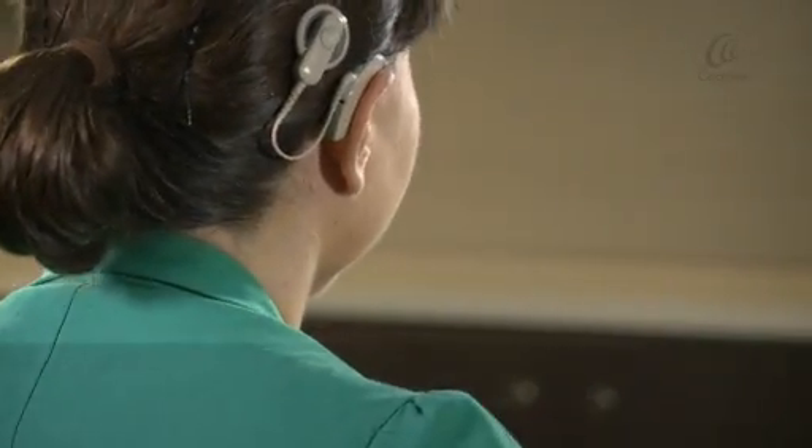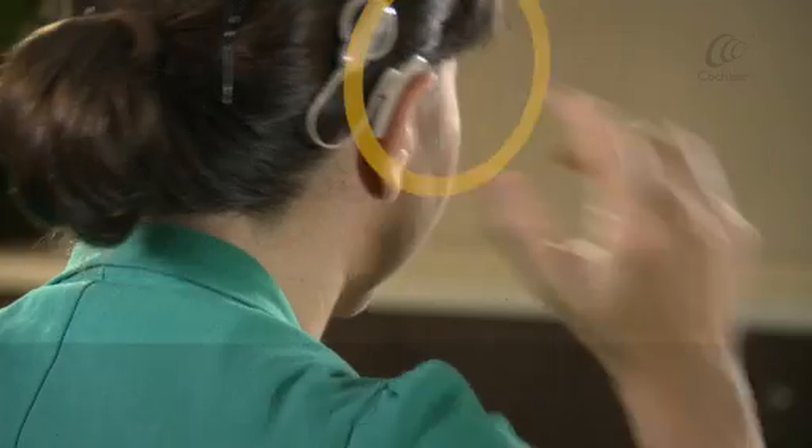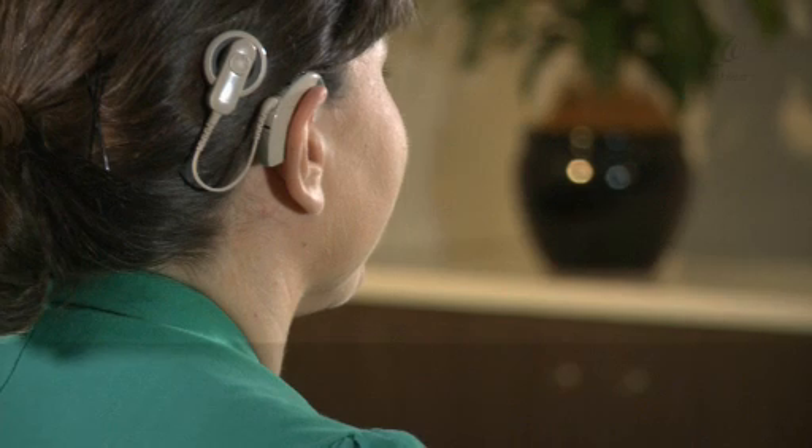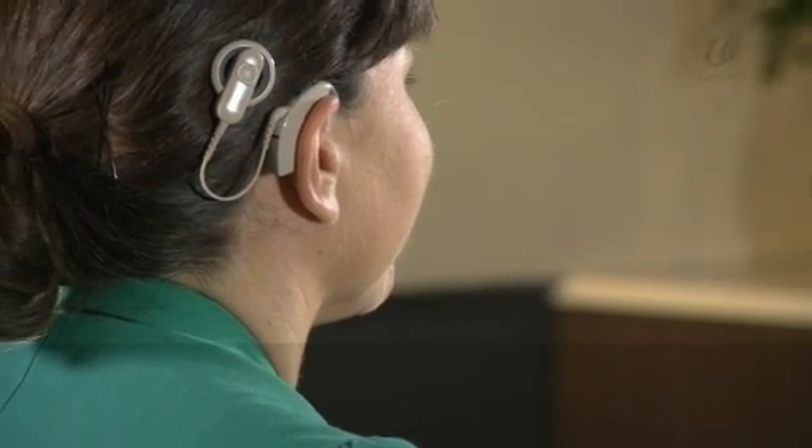Quickly press the top button to turn the telecoil off. When the telecoil is activated, you'll also be able to use a Bluetooth headset.